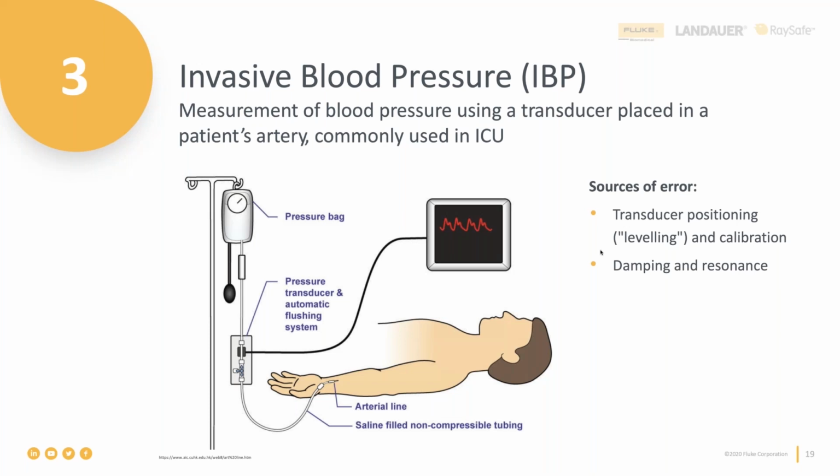There's actually quite a wide range of those types of procedures where only invasive methods of blood pressure checking should be used. It is also required when it's important to promptly control blood pressure, for example, when a patient has aneurysms or induced hypotension.